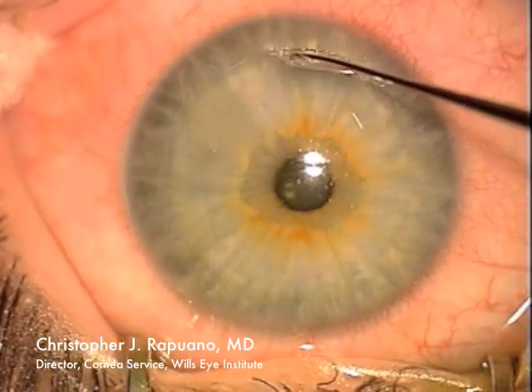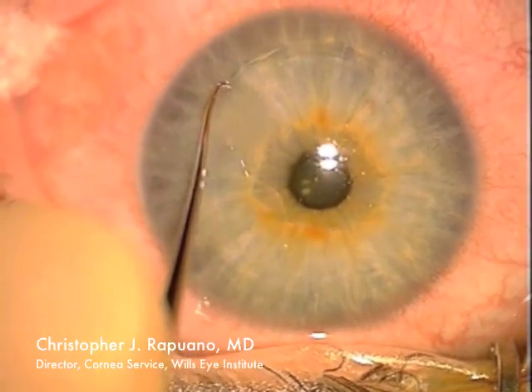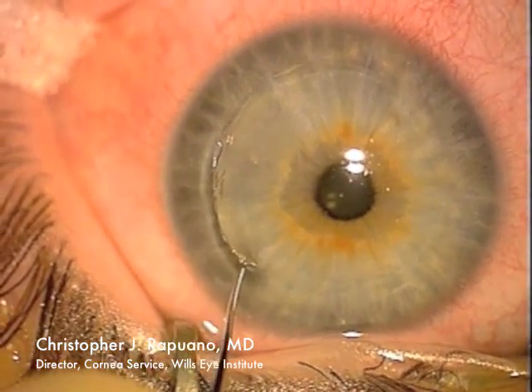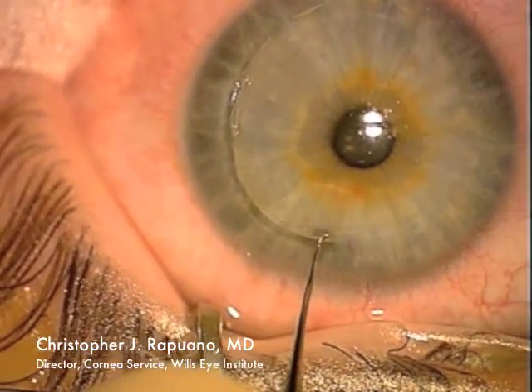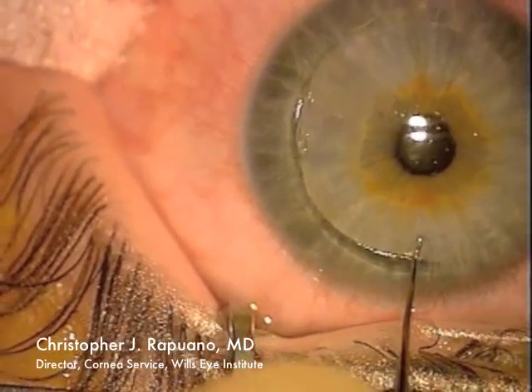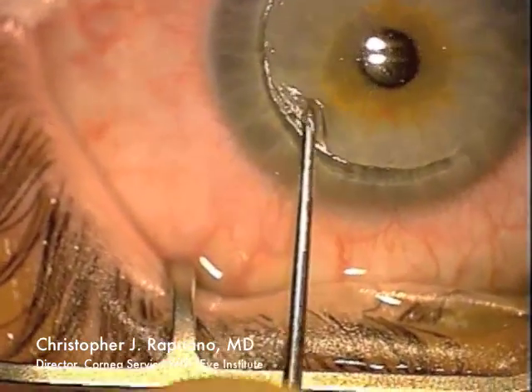There is a nasal hinge at the right side of this video. The Szynski hook is again used to open up the edge of the flap for as much of the flap as possible, because I'm planning to lift up the entire flap in this case to remove large degrees of epithelial ingrowth.